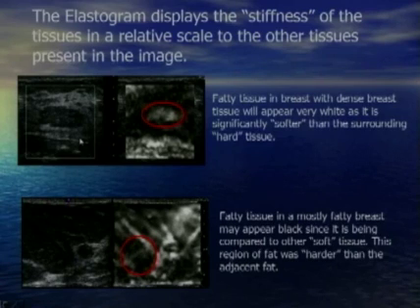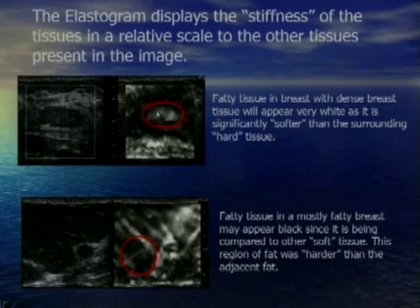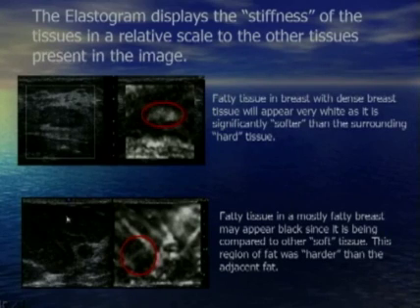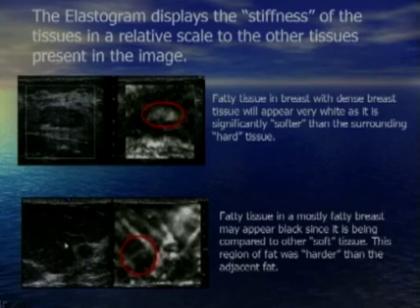This example shows how tissues can appear in different shades based on what's in the field of view. In the first image, a fat lobule surrounded by dense breast tissue shows up as white on the elastogram — much softer than the surrounding tissues. However, in the second case where almost the entire image is fat, a circled area of fat shows up as black because it is the stiffest fat within that image.